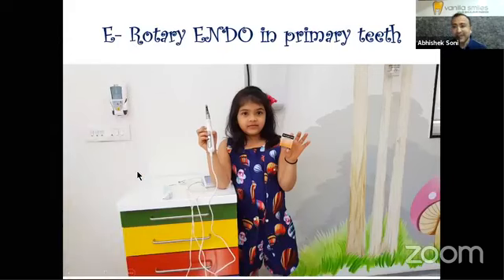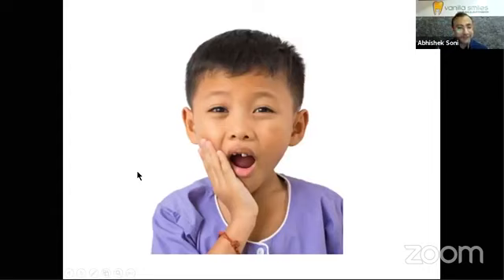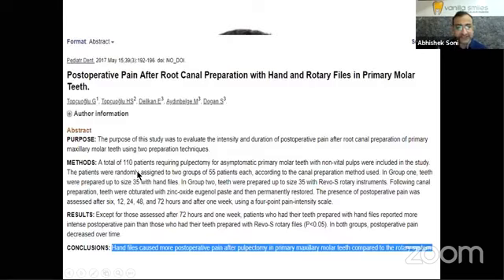So we all are aware about how rotary endodontics has revolutionized our practices and the way we do root canals. We now have pediatric rotary files which are about 16 to 17 millimeters in length at our disposal, with various tapers provided by ProAF, Baby Gold, and your Kedo-SG pediatric rotary files. And there is a lot of evidence besides making the procedure quick, which is important when you treat these little ones, about wrapping the procedures fast.